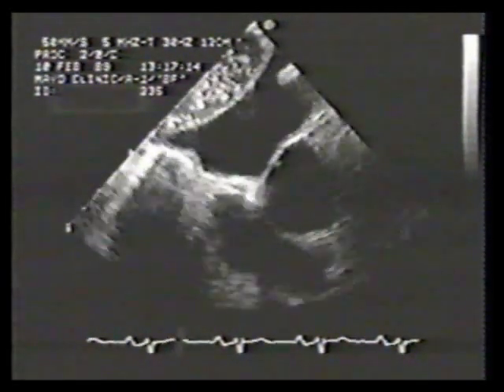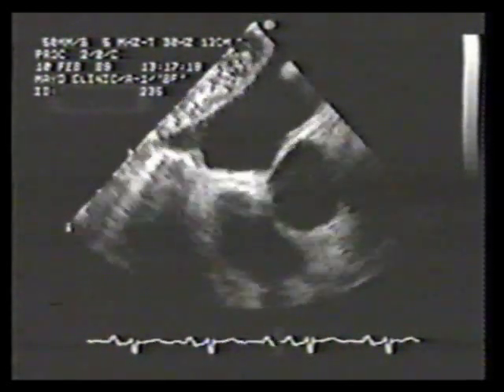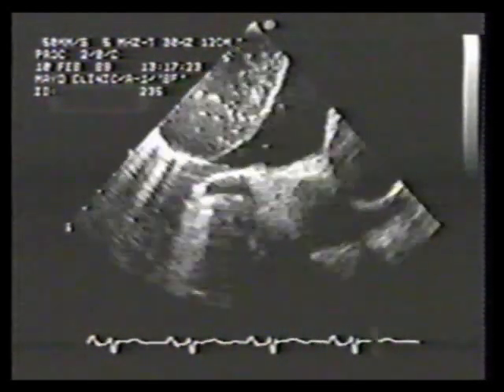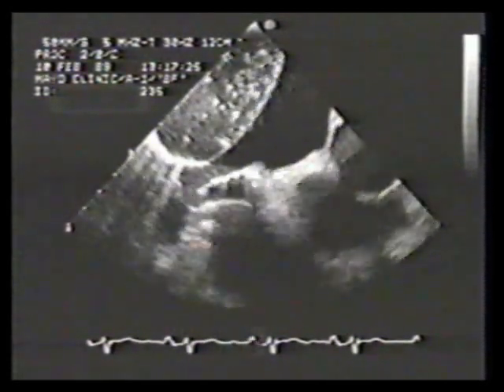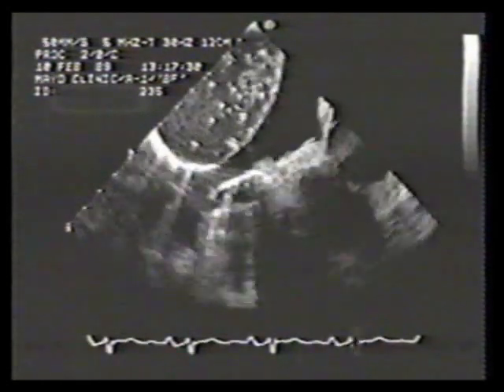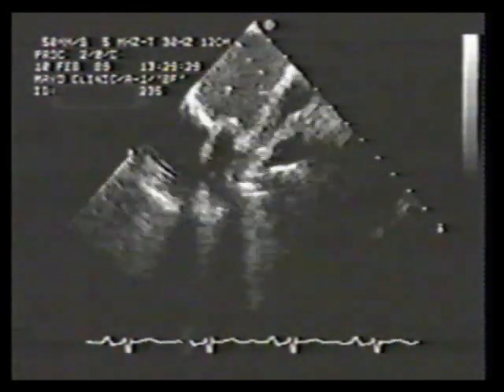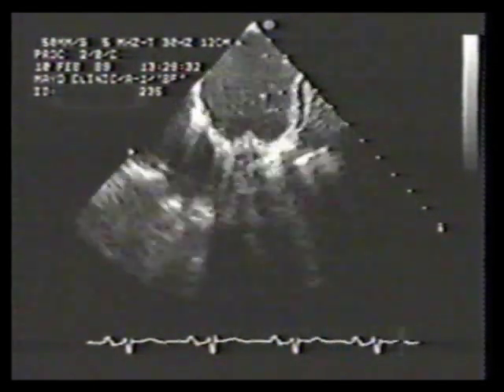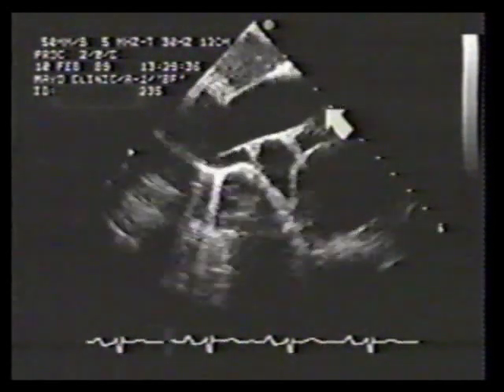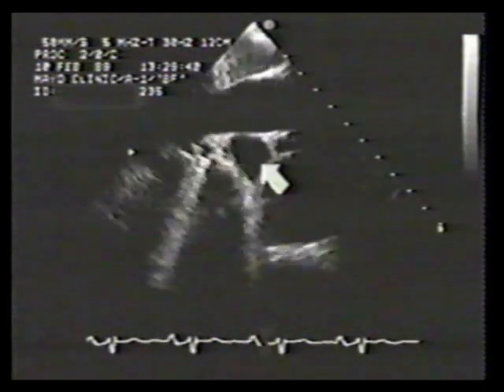In real time, the mass has an undulating appearance and irregular consistency and was most typical of a bronchogenic cyst which compressed part of the left atrium but did not appreciably distort the right pulmonary artery or the other mediastinal vascular structures. With further superior scanning, in fact, the right pulmonary artery, as exemplified by this arrow, is not compressed, nor is the aorta or superior vena cava.